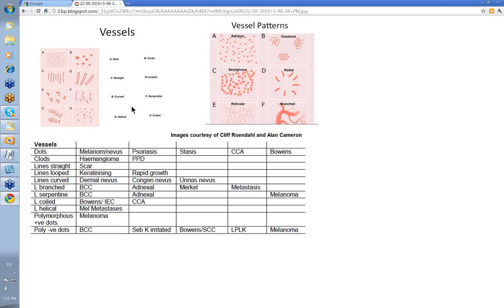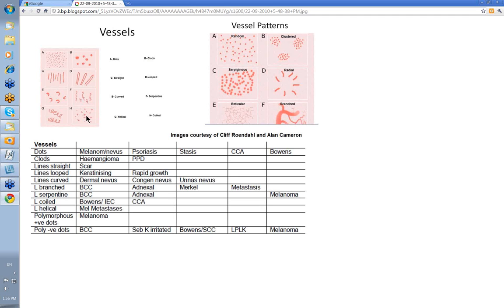These two images here are courtesy of Harold Kittler, Cliff Rosendahl and Alan Cameron. They've described vessels as dots, as straight lines, as curved lines, as helical lines, as clods, looped vessels — these were the hairpin things — serpentine vessels, and coiled vessels that you see in SCC in situ. These vessels can be arranged in certain patterns.